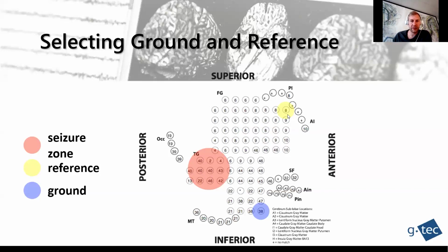Usually we like to have similar, overlapping characteristics between the electrodes. So an intracranial ground electrode could be, for example, a grounding strip or a white matter electrode in a shaft, or sometimes it could be, for example, a skull-based ground.